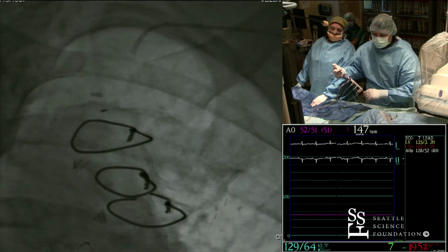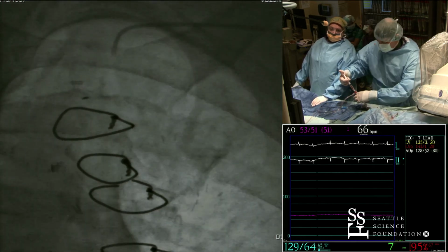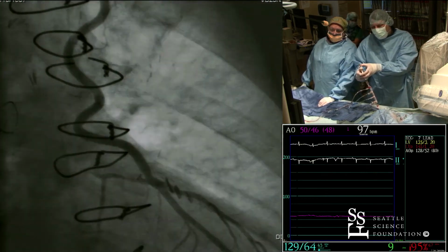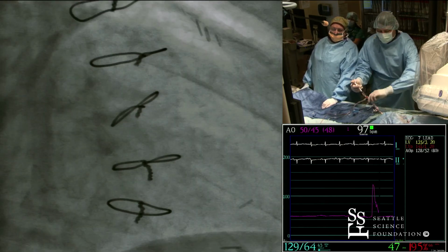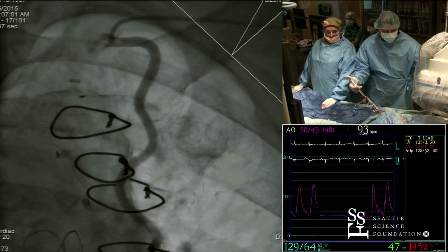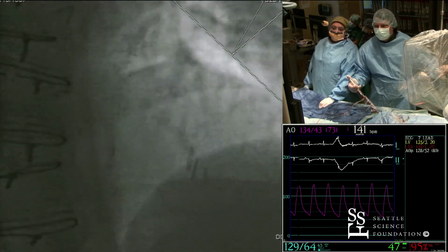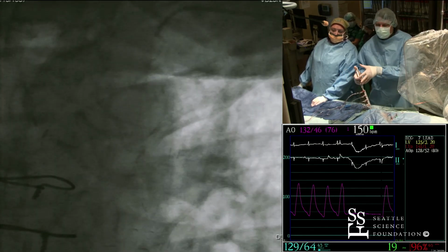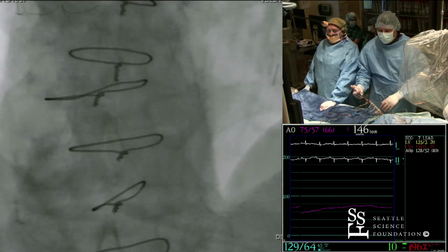So you see the takeoff, how that goes, that actually the LIMA is kind of taken off this way and then coming down, and that's why a little bit more of a hook ends up being good. You're going to feel warm in your arm there. So he got right in it, and it's a big graft. Wow. Look at that thing. Wow. Look at the right. Go to the right. Okay, it's got epicardial. Well, that's nice looking, John. Yeah, it's a good looking graft. There. Look at that distal right. It's a tasty CTO.